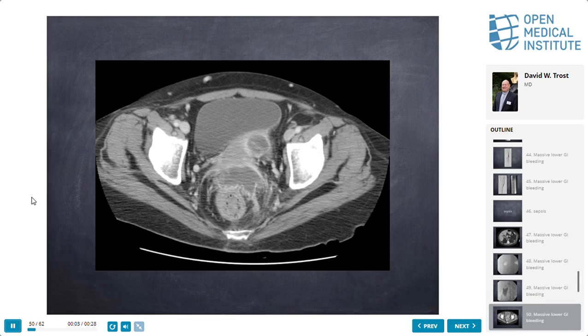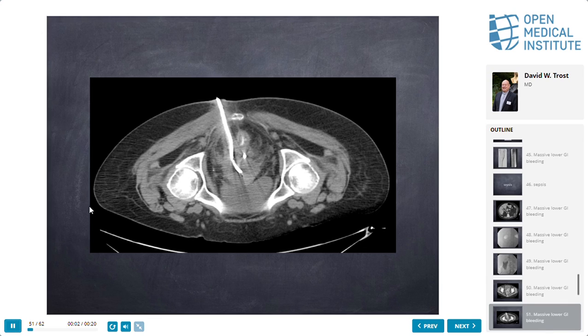Sepsis, again, people can come in. Usually, it's amazing to me, sometimes people can have very large abscesses and you'd never know they were sick. And sometimes you can have very small abscesses and people can be very sick. In this case, there's this collection anterior to the rectum, and that's an abscess, and it's a simple drainage procedure. This is a prone patient now.